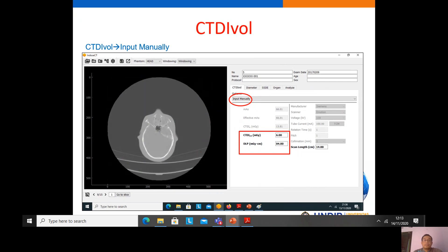The third method to obtain the CTDIvol is from the CT console. The value of CTDIvol is read from the CT console and then manually input into the software, because to calculate the size-specific dose estimate we need these values of CTDIvol and DLP.